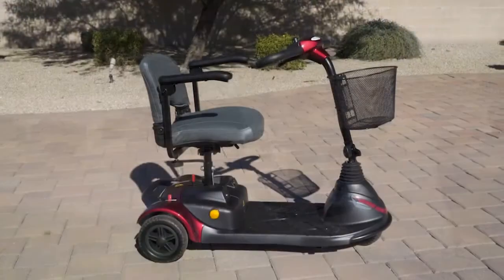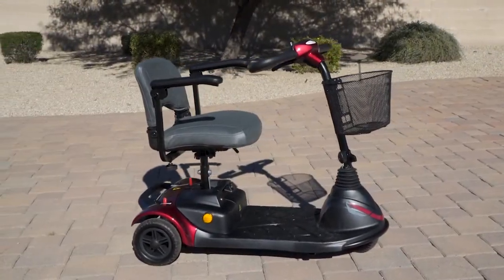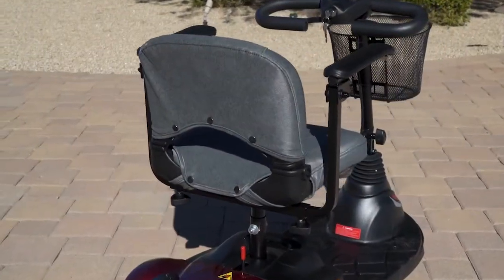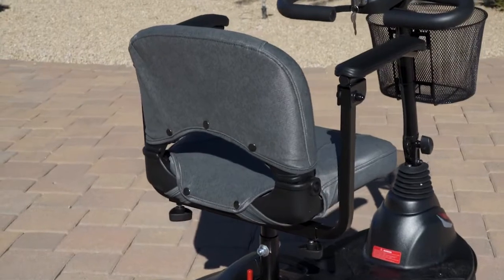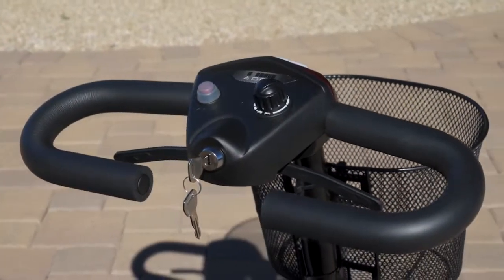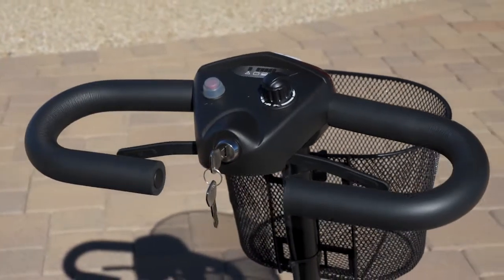The EWM40 has a 300-pound weight capacity to suit virtually any rider and features a non-slip platform and a swivel executive seat that has a convenient snap-on seat cover for easy cleaning. You'll also find easy-to-use controls on the Delta Tiller that makes it easy to ride.